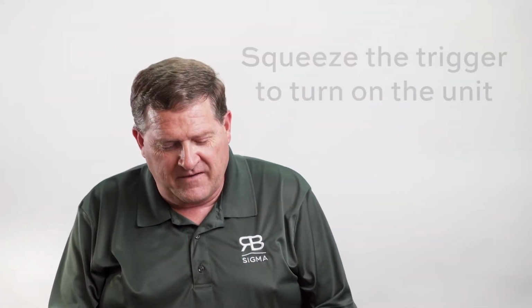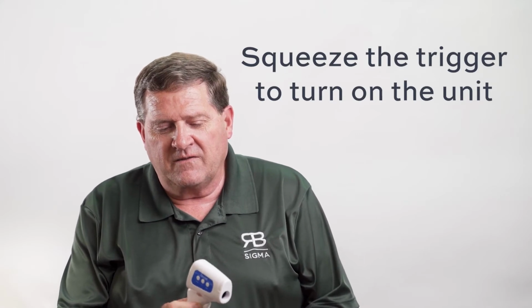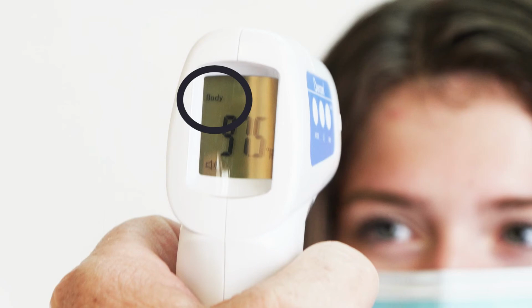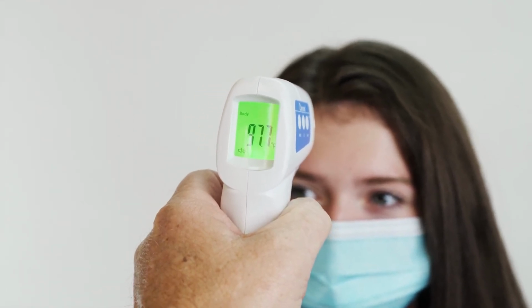To turn the unit on, you will squeeze the trigger and you will see that the screen lights up. With the screen lit up, you will take this mode button and depress it a couple of times to get the screen to say body temperature. At that point, you are ready to point it at someone's forehead 6 to 8 inches away, depress the trigger, and it will record the temperature.